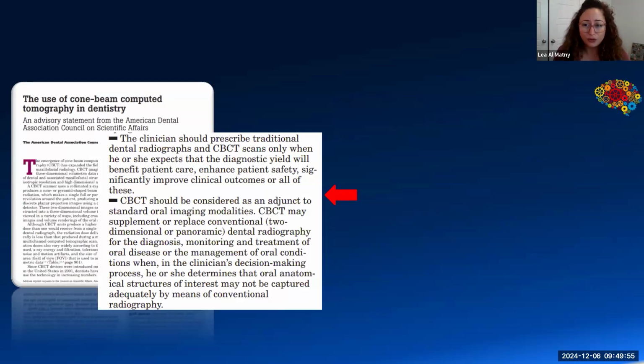Especially with endodontists, those guidelines have bulleted points: 11 out of 14 of the recommendations suggest using cone beam. The other three are really when the patient is asymptomatic, when you're doing a follow-up, and there is absolutely no reason, not just to not take a scan, but to not do a root canal treatment as well.